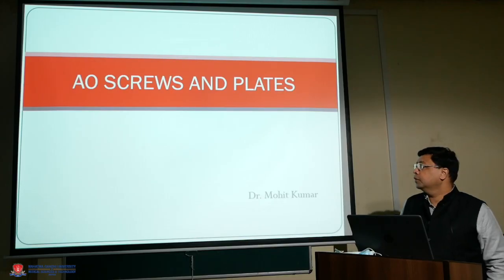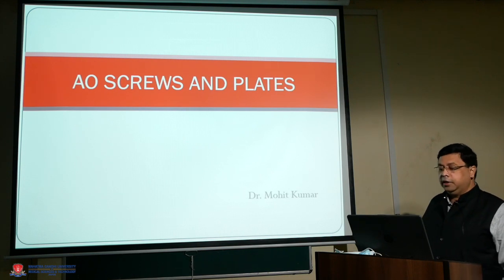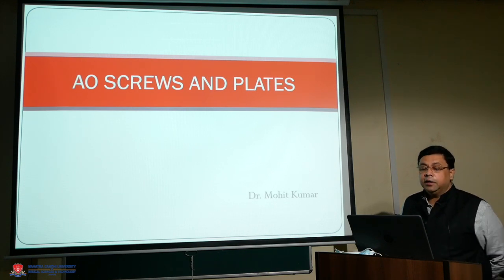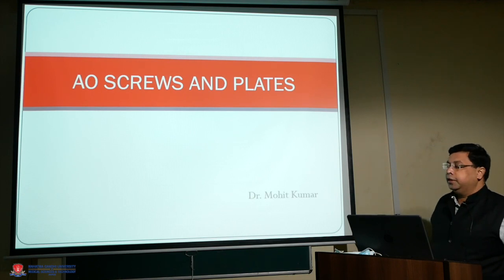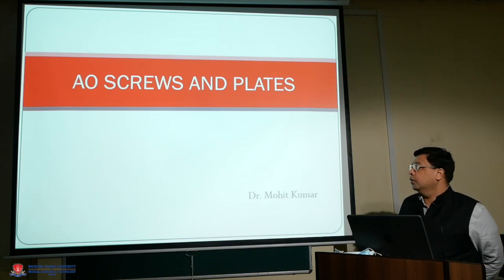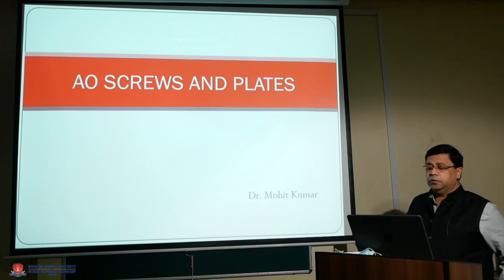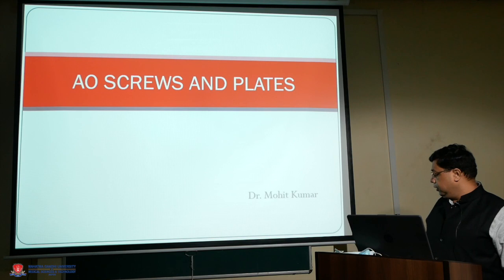Good morning. Today we will talk about screws and plates. As you know, there are many implants used in orthopedics to fix two fragments of the bone. It may be due to trauma, removal of a tumor, or an osteotomy to correct deformities.